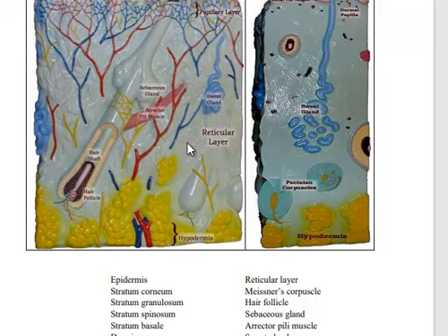This picture is a three-dimensional representation of the skin, a cut through of the skin. And this one is as if you had sliced it and put it on a microscope slide. So instead of seeing the whole sweat gland sticking out like you're seeing it here, you're seeing where they've sliced through it. So in your mind, you have to connect these into these coils over here.